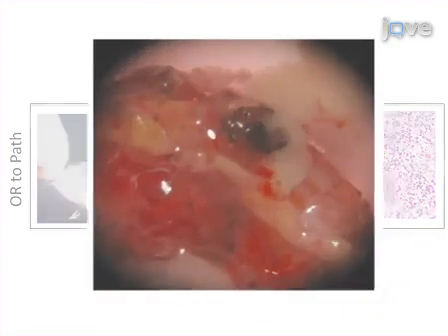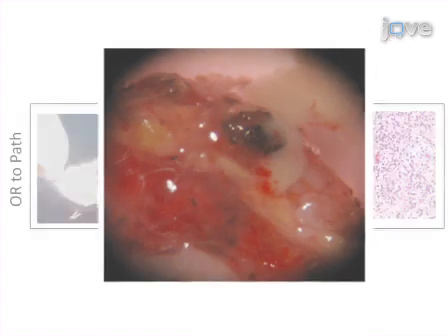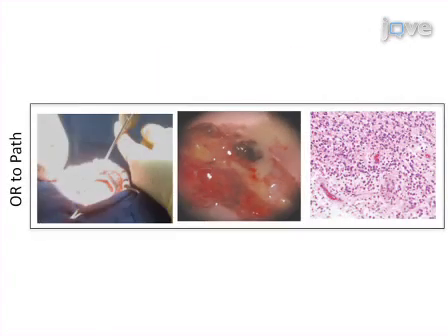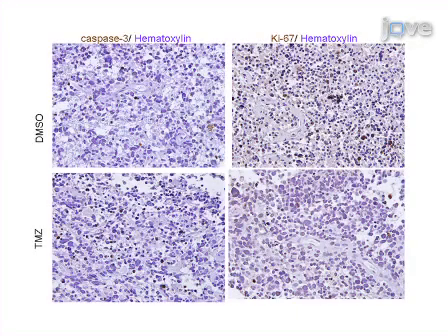Then, in the research laboratory, tumour explants are dissected into multiple smaller tissues and transferred into optimized medium. Finally, intratumoral injections with drug candidates are performed and the explants are incubated for 16 hours. Ultimately, results can be obtained that reveal the efficacy of treatment through hematoxylin and eosin staining, as well as immunohistochemistry with cell type specific markers. We can also evaluate drug efficacy in vitro using flow cytometry and neurosphere forming assays.